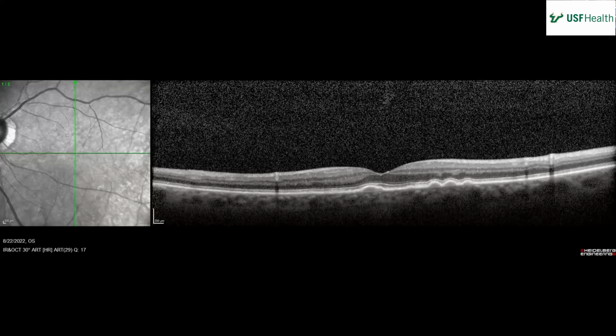So we're at 53 seconds and then the choroid's finally starting to light up. Yeah, correct, delayed choroidal filling time. And then anything else that you can appreciate at this point?